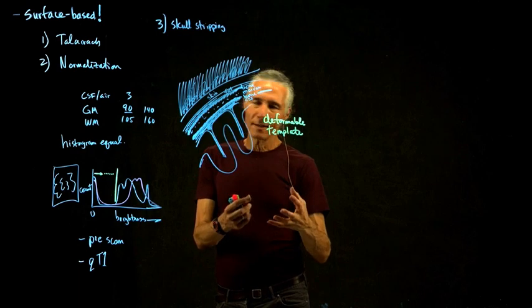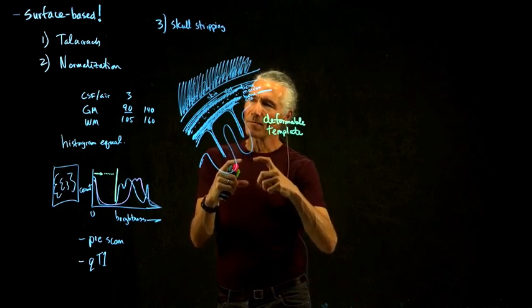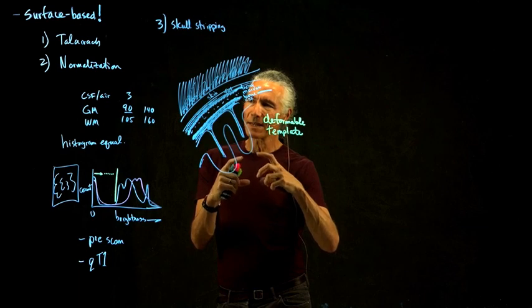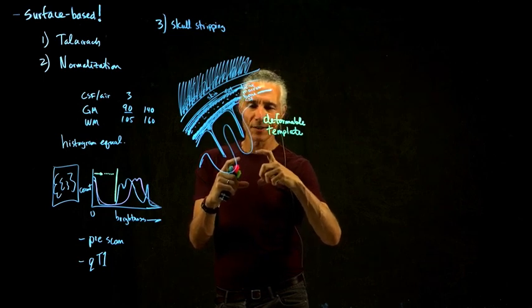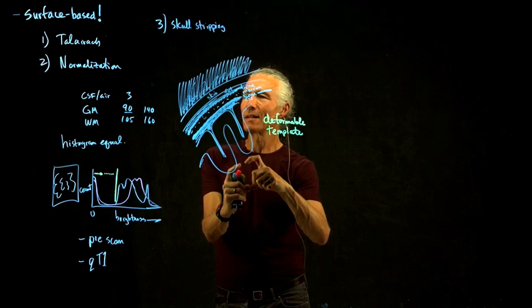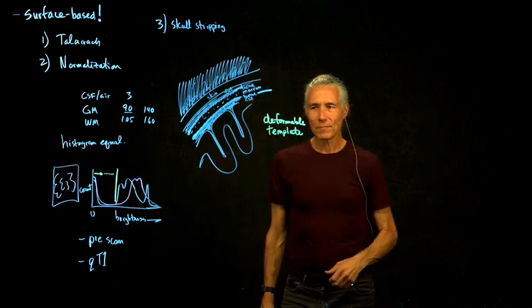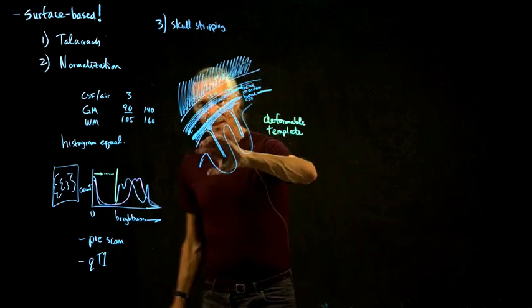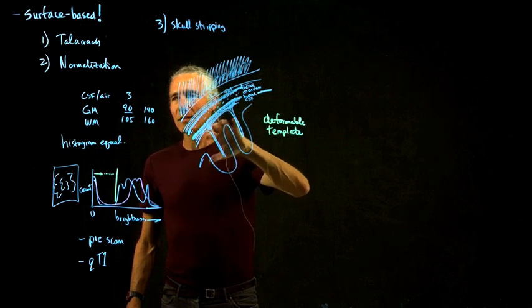If you know that all flowers have sort of a round shape, then one way of recognizing them is to make a canonical flower shape, a typical flower shape, and then just try to squish that flower shape into alignment with something in the image to recognize a flower. And so we know that the surface of the cortex should be a relatively smooth surface.